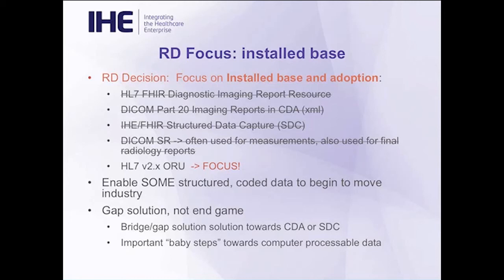We took the HL7 ORU message and began to focus on identifying some structured and coded data to begin to change how ORU messages are typically sent today, with the intent of this being a gap solution, not a final solution. So this profile is written in an attempt to move towards structured reporting as opposed to being an end solution, and it is not intended to compete with CDA or structured data capture.